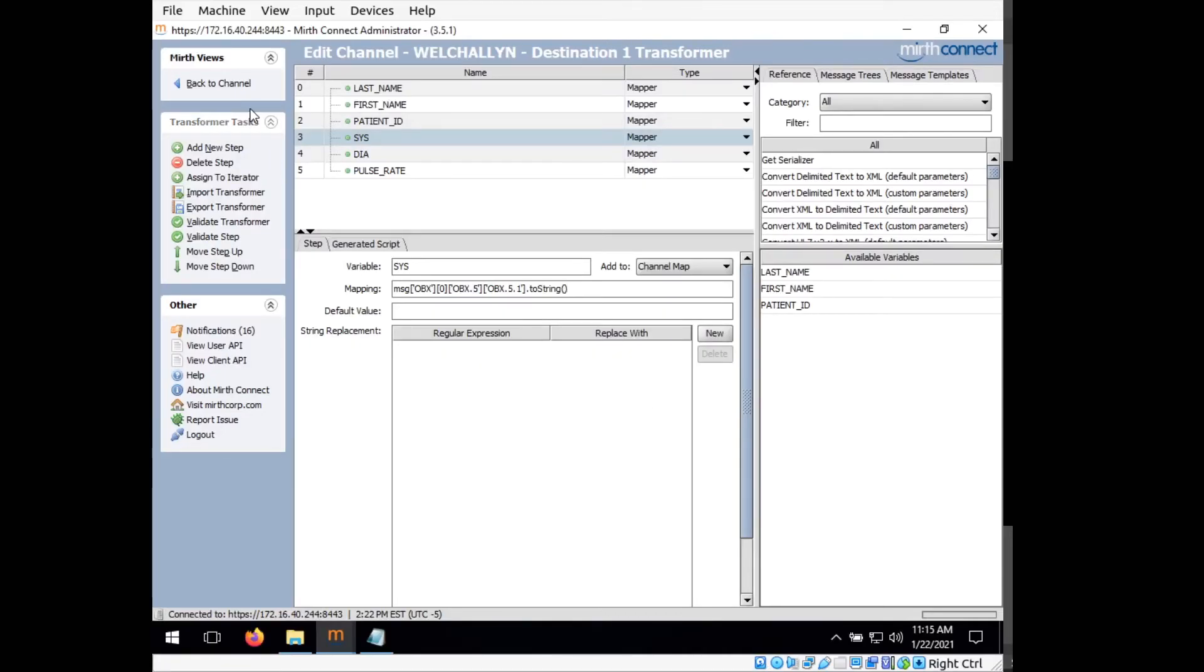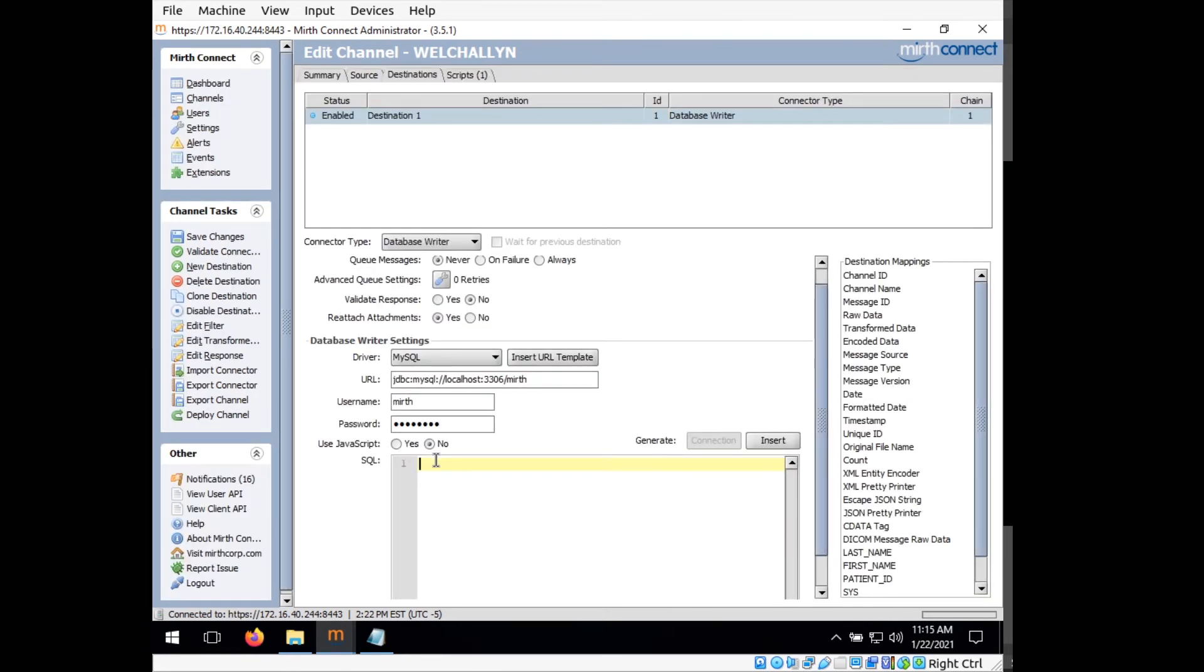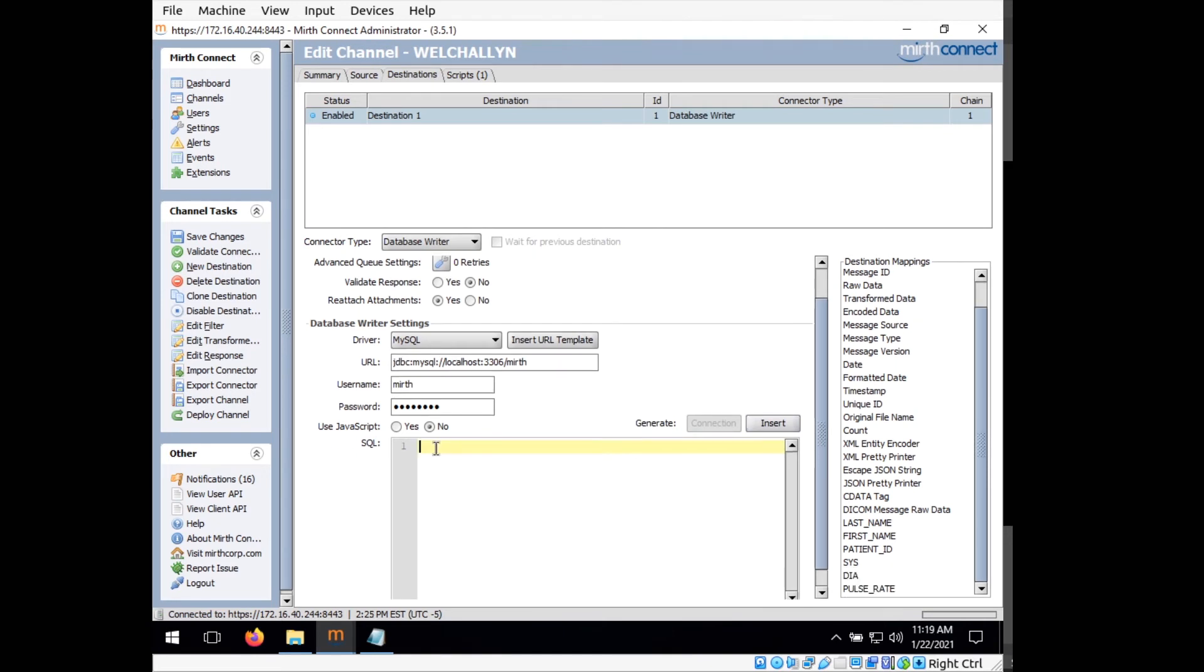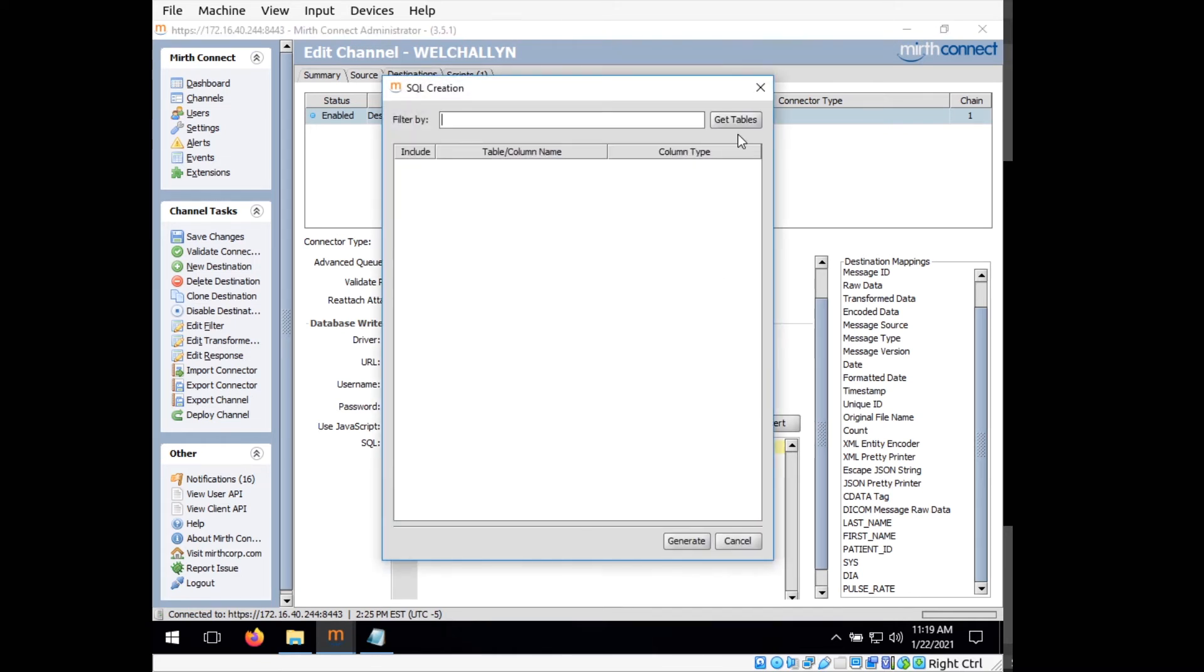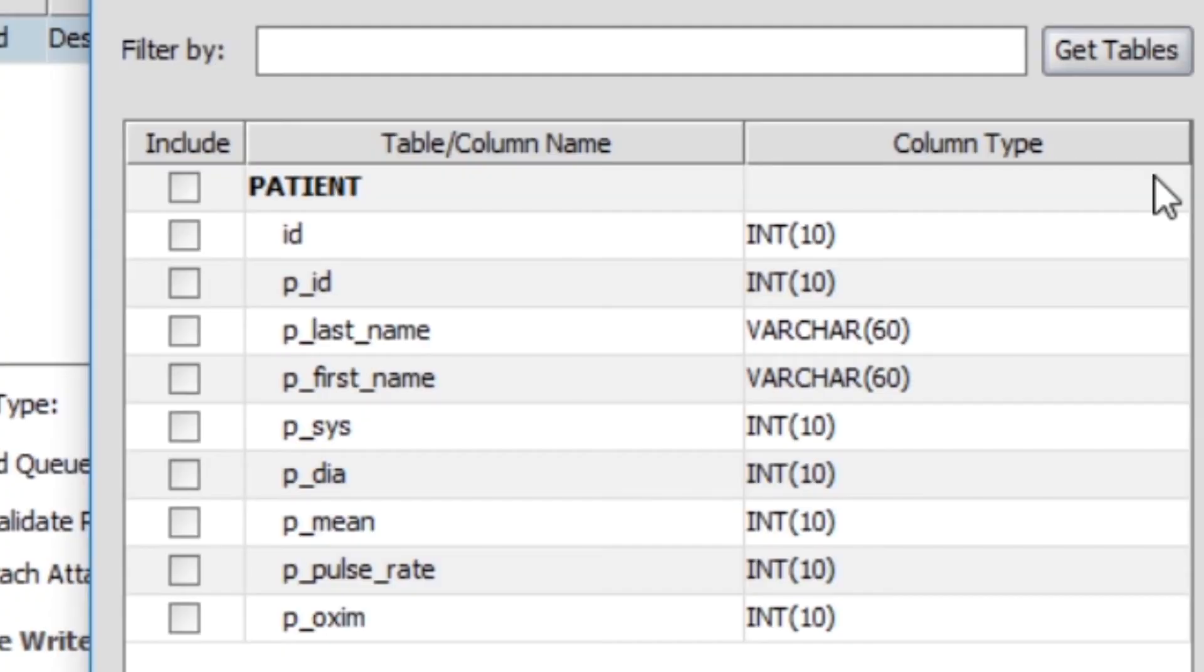So now we can go back to channel. And under SQL, this is where we will go ahead and create our query that's going to be used to send data to the database. So now we can start generating our query. What I'm going to do is click generate or the button insert next to generate, and click on get tables. What get tables will do is it's going to access our database and find everything we've set up before. So it sees that we've made our patient table with our values here.